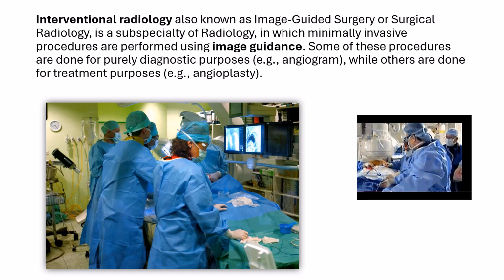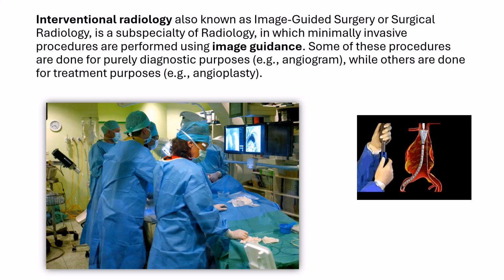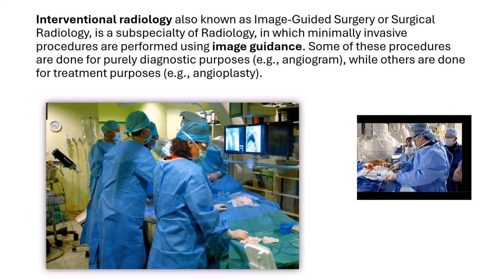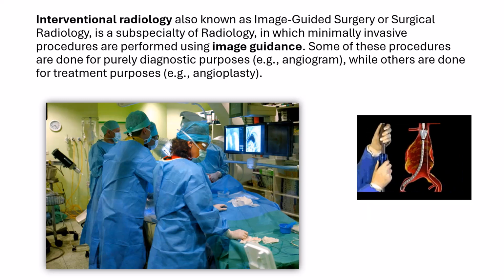Interventional radiology, also known as image-guided surgery or surgical radiology, is a subspecialty of radiology in which minimally invasive procedures are performed using image guidance. Some of these procedures are done purely for diagnostic purposes, such as an angiogram, while others are done for treatment purposes, such as angioplasty.